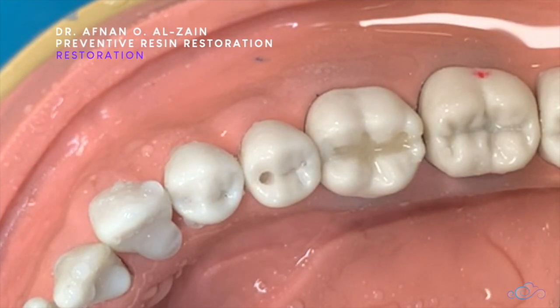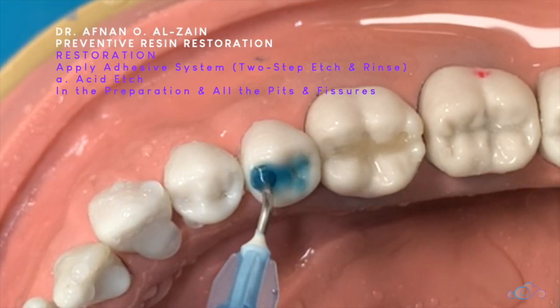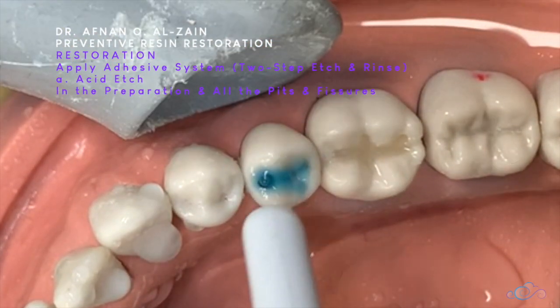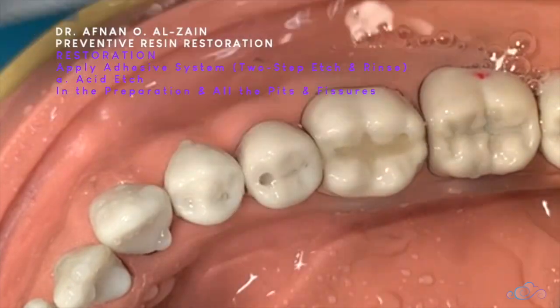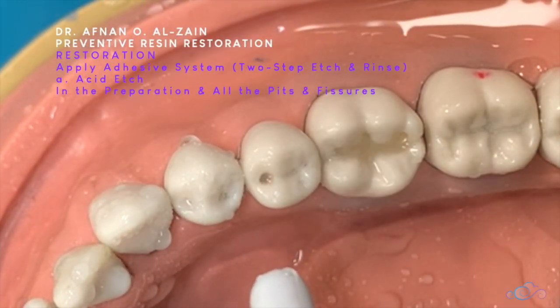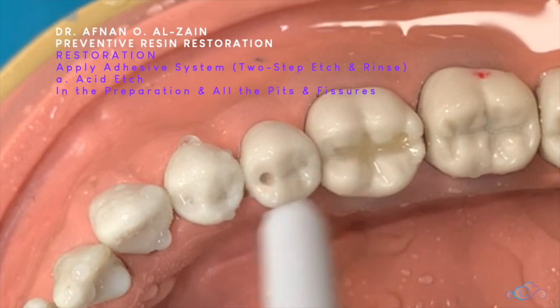We applied the acid etch according to manufacturing instructions. We rinsed it, and after that we're going to apply gentle air pressure.